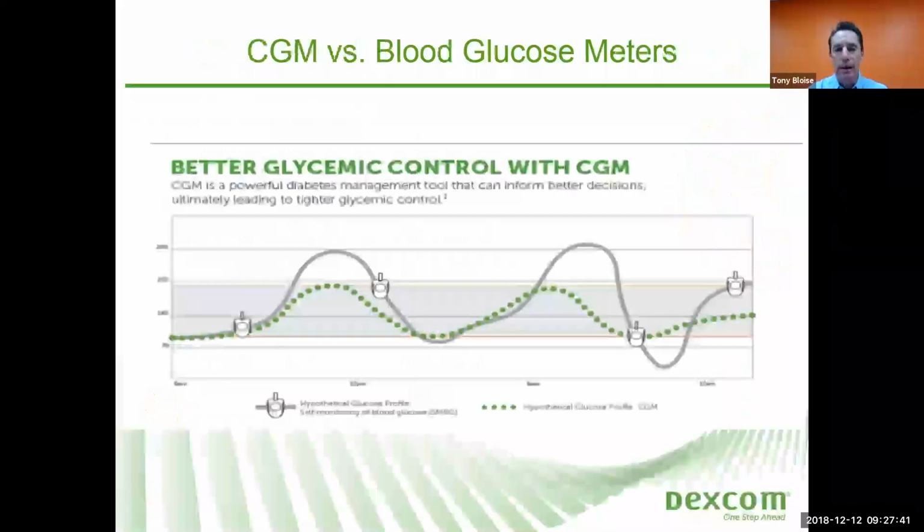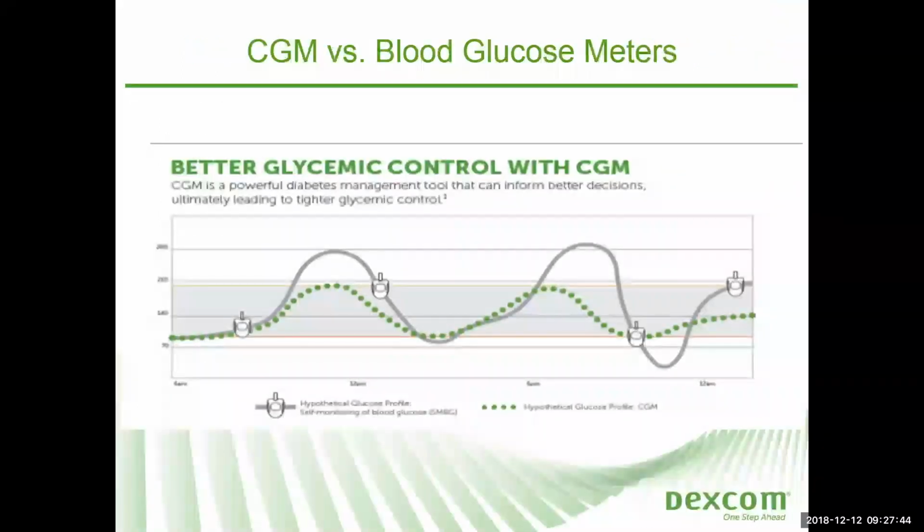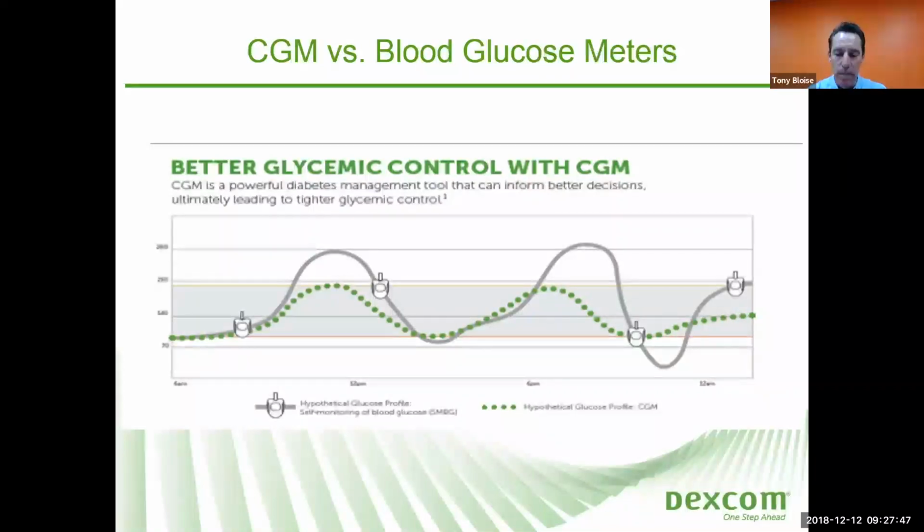So what are continuous glucose monitors? I'll explain what they are in just a minute in terms of the components and how they work together to give you this information. But essentially, they have three components: a sensor, a transmitter, and then a display device. The sensor is a very small medical device that the patient puts on themselves. It's about the size of a Lego, so it's fairly small. Patient puts it on themselves, and what I mean by that is that there is a small sensor wire about the thickness of 2 human hairs that goes just under the skin.